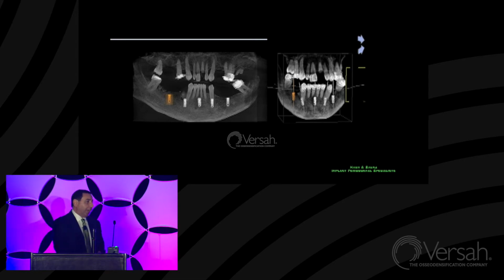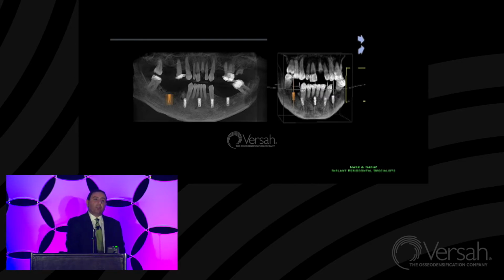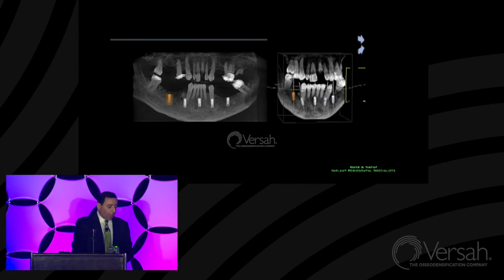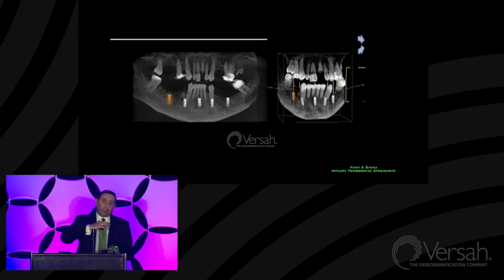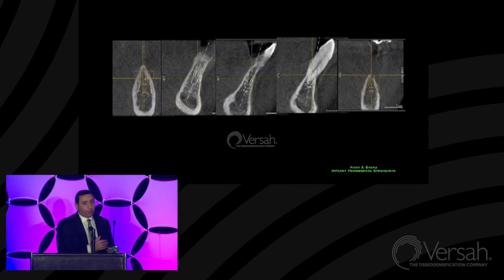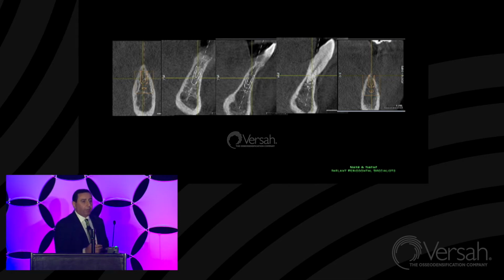So the treatment plan by Dr. Esquivel was for us to extract the teeth. He'll make a denture, and we're going to convert the denture on the lower arch for immediate implant restoration. If we take a look at the ridge, when you're doing a hybrid type prosthesis, you need at least 15 to 18 millimeters of inter-arch space for all the hardware that's going to go on top of it. When I took a look at the ridge, I realized the space is limited, and Dr. Esquivel was asking me to reduce at least 2 or 3 more millimeters from the ridge height, which worked fine because the top of the ridge was quite thin to begin with.